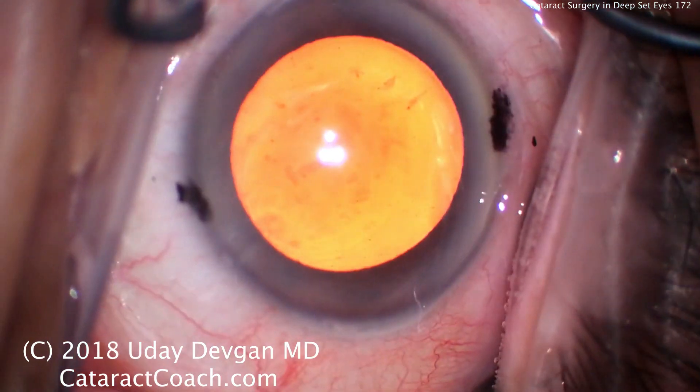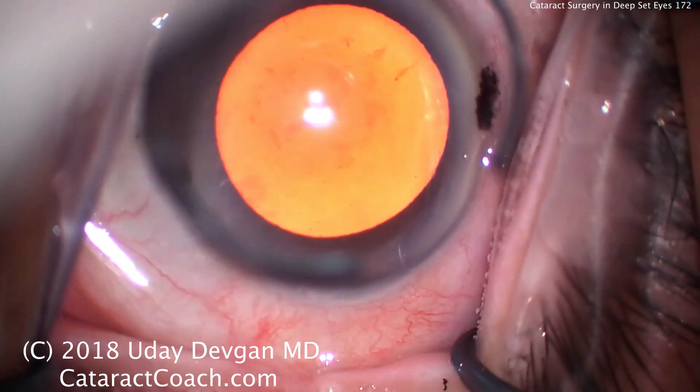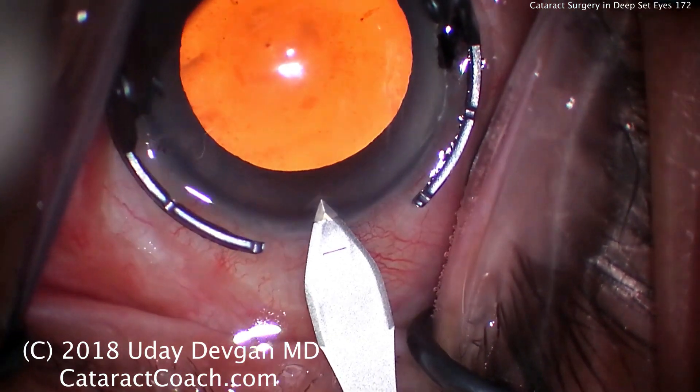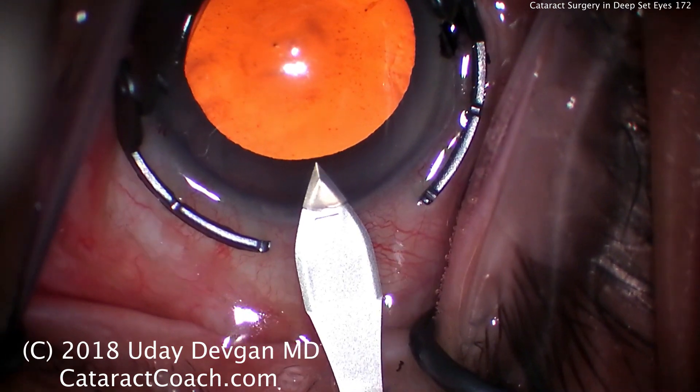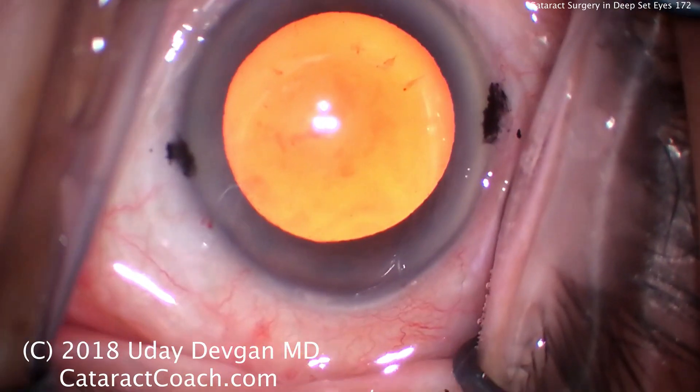Maybe a wick of some sort would be helpful here. Viscoelastic going inside the eye to protect the cornea, and we'll make our incision. Now, very important to make a great incision because that's going to set up the rest of the case. If it's a bad or leaky incision, it's going to cause issues throughout the case. And this is the kind of patient where, with a deep-set eye, we don't want any other issues.